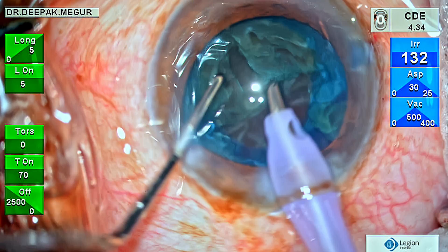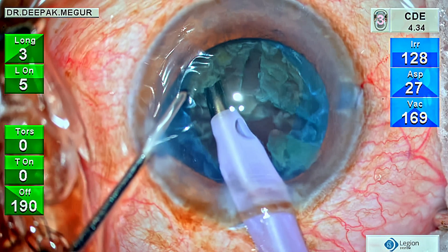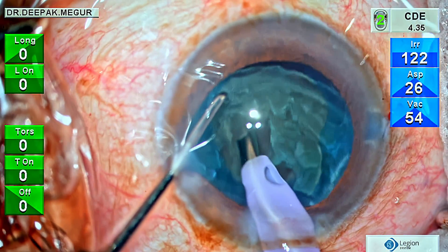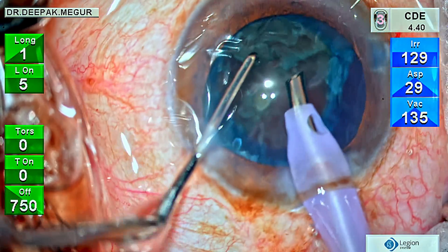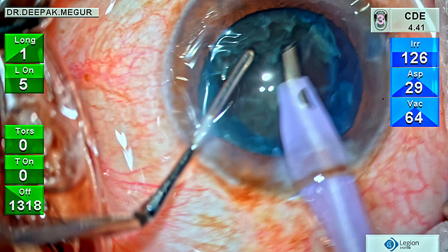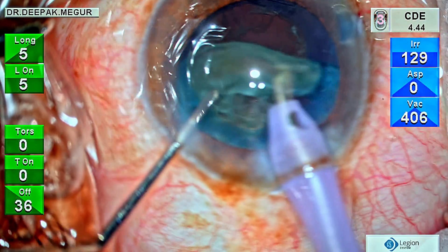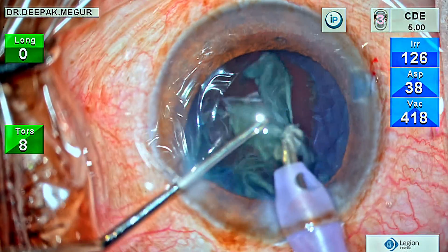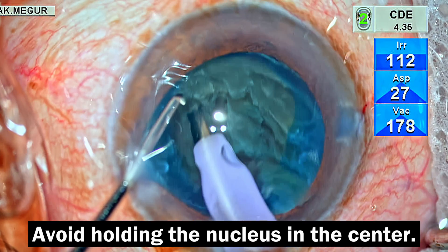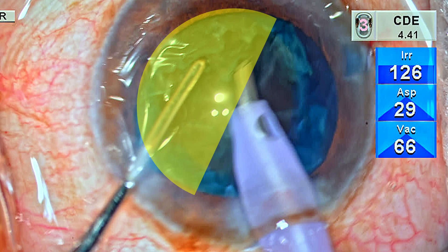Now in slow motion: this is the remaining heminucleus. If I hold at the central part, I cannot get a good grip even with very low power, and even with a grip I won't be able to flip it. The trick is to go ahead and hold it at the far edge of the heminucleus — using extremely low power, ensure the tip is occluded, and once the vacuum builds, just flip it out of the bag. Holding it at the edge is the secret; once you flip it out, emulsifying the heminucleus is a child's play.